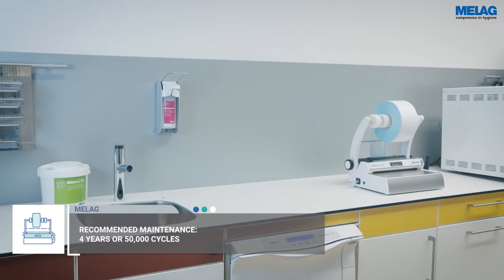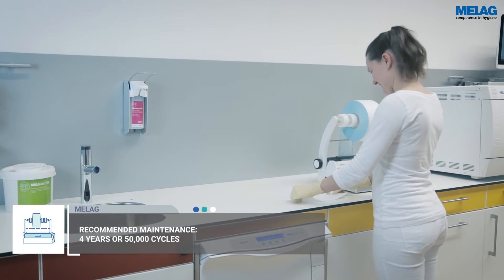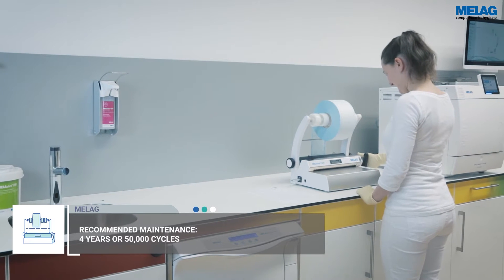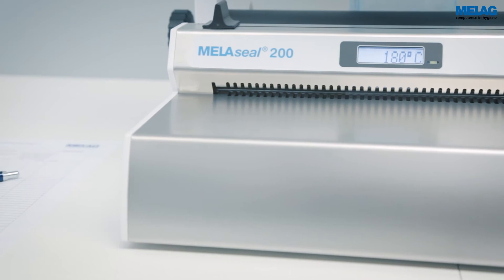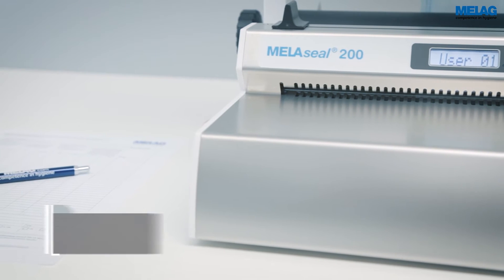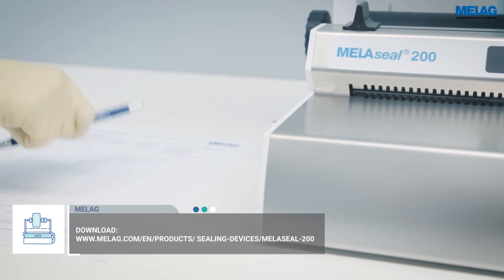In addition to the maintenance of the MELAseal 200 by a trained service technician, you can control the function of the sealing device with routine checks. Document the results of the routine checks with a checklist. You may download a template from the MELAG website.